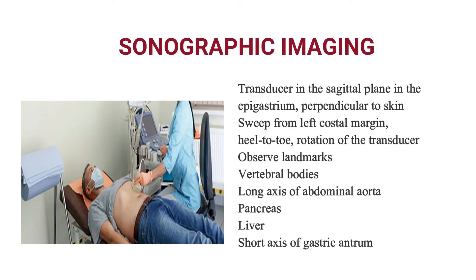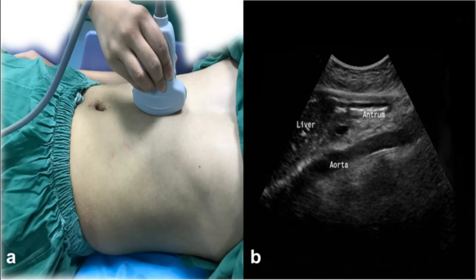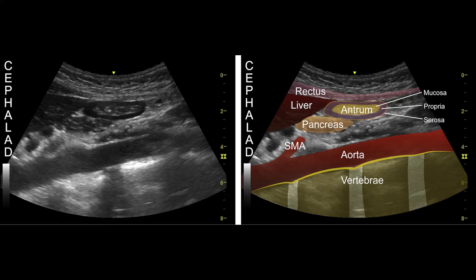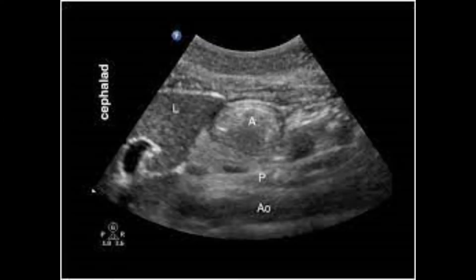Initially the transducer is placed in a sagittal plane below the xiphisternum. The landmarks from deep to superficial are: vertebral bodies, long axis of the abdominal aorta, head or neck of the pancreas, inferior margin of the left lobe of the liver, and the gastric antrum in short axis.